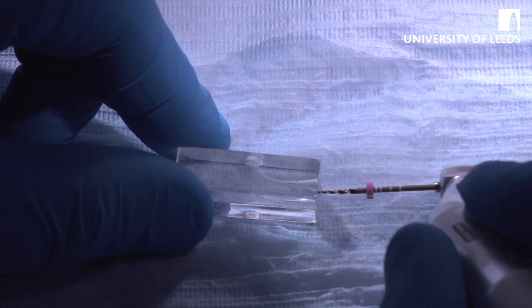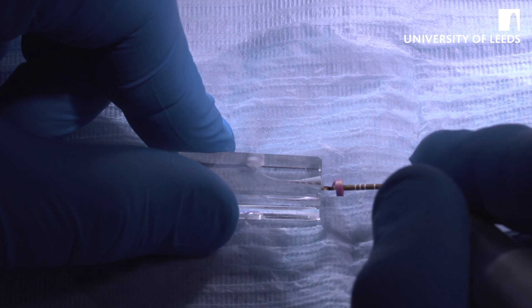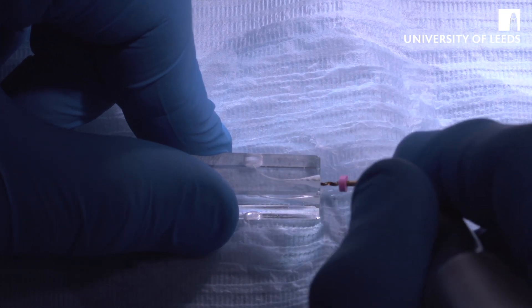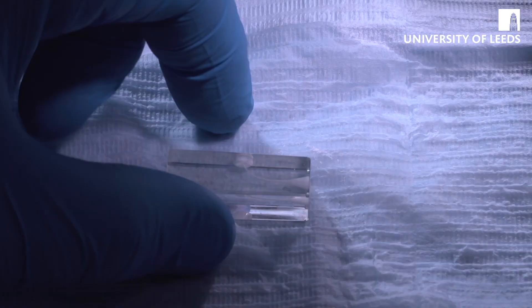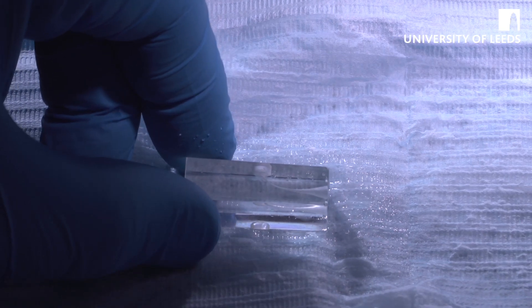We put the S1 in as far as it will go — in this case it will go virtually to length. Using it in the same motion: passive insertion and then brushing on the way out. It's critical to remember that ProTaper Gold files cut on the outstroke. As we do more and more shaping, the file is just passively going to length without having to force it. Take the Shaper 1 file out, irrigate again, then patency file to remove debris.